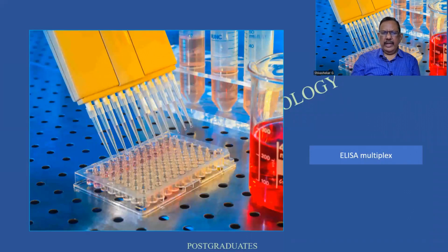So this I have already explained. I would like you people to kindly appreciate it. Only thing, the precision has mattered, and all of these are being adjusted by means of fine instruments called microtip pipettes.